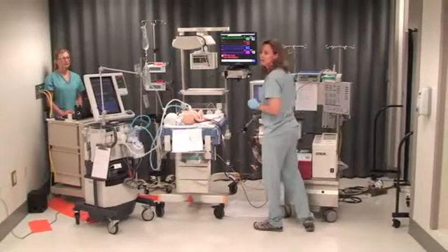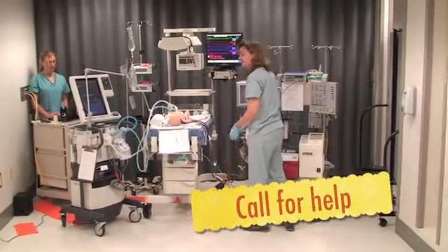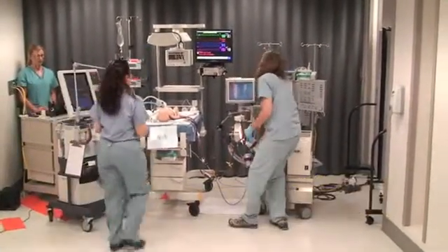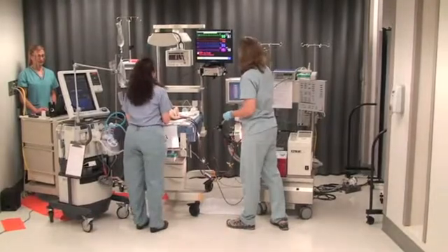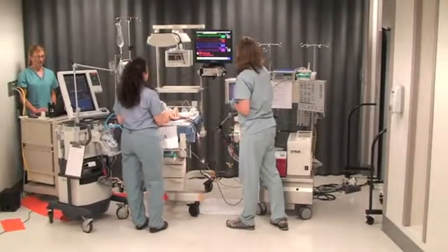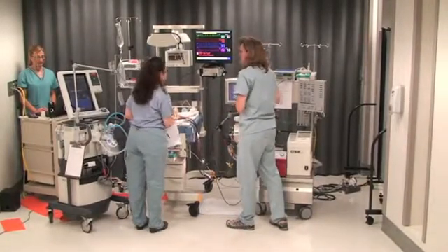Can you call the ECMO MD and the nurse on duty, please? I'm not the ECMO nurse, I was just a patient. The patient is getting a little bradycardic and hypothermic, so I'm wondering if something's on — is something on?